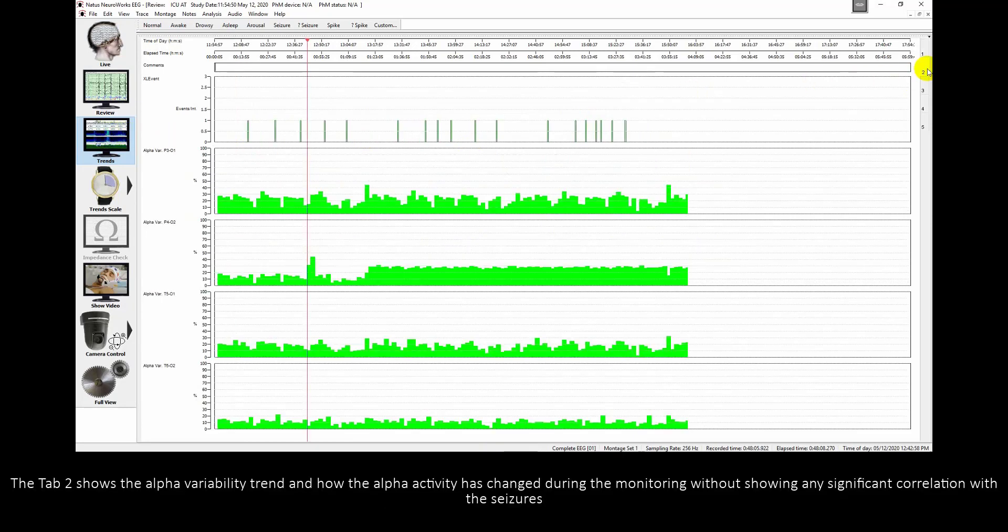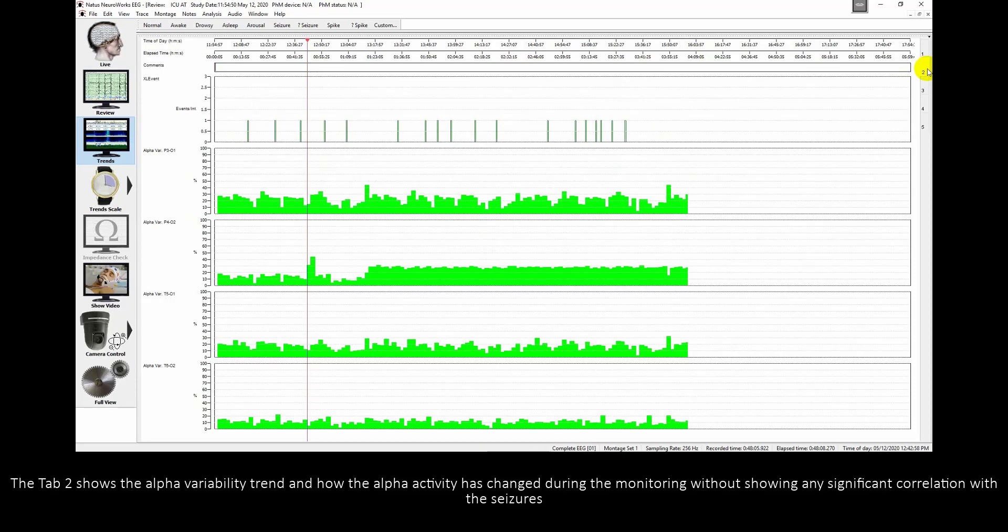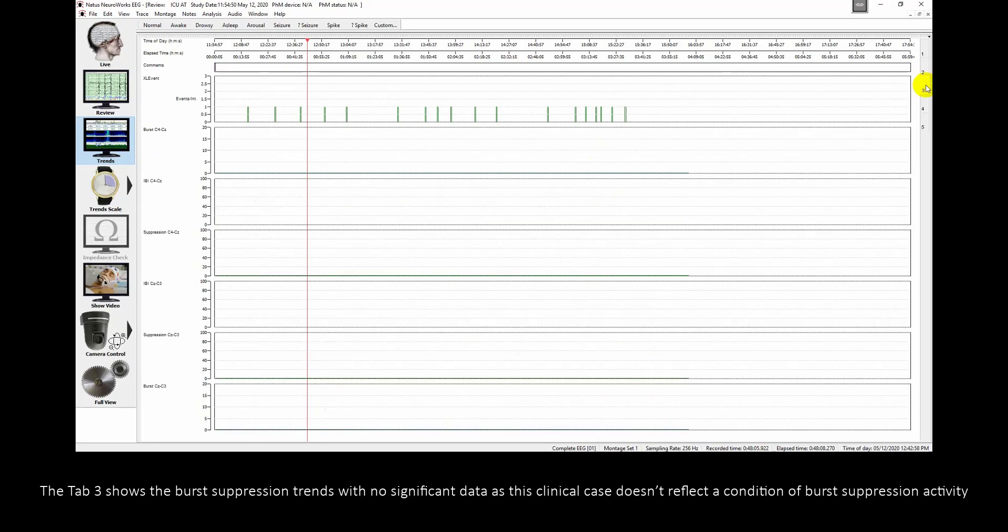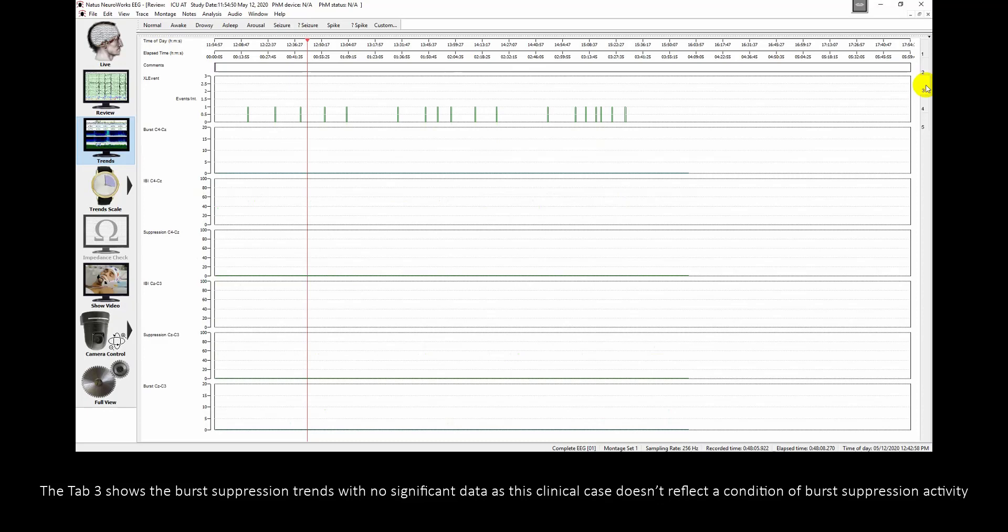Tab 2 shows the alpha variability trend and how the alpha activity has changed during the monitoring without showing any significant correlation with the seizures. Tab 3 shows the burst suppression trends with no significant data as this clinical case doesn't reflect the condition of burst suppression activity.